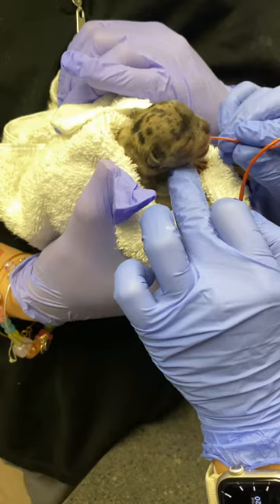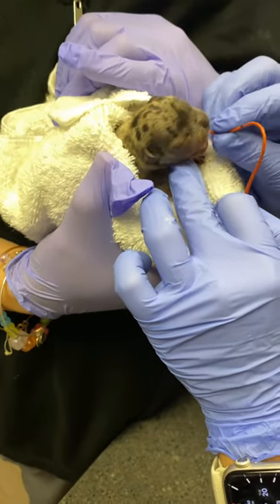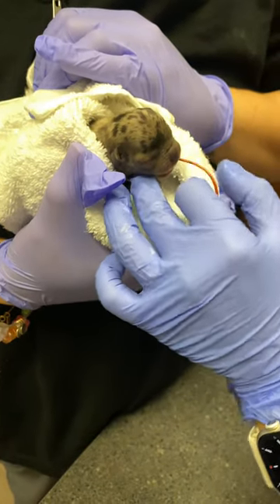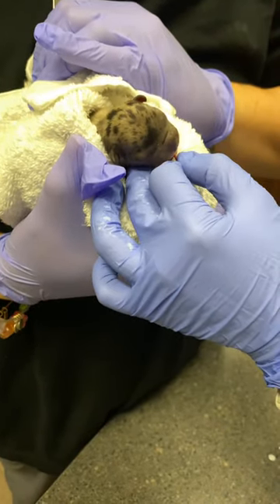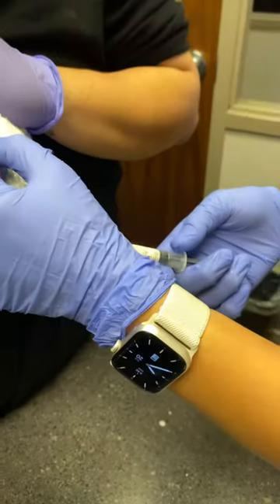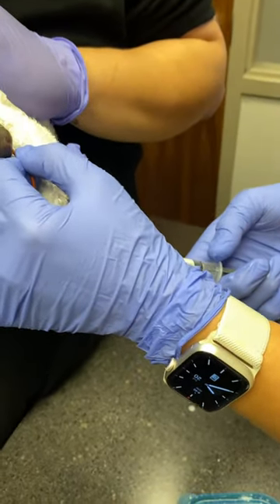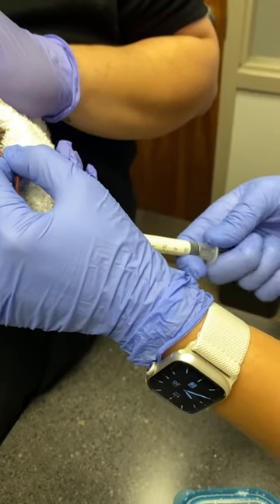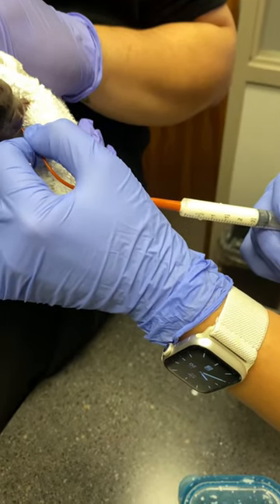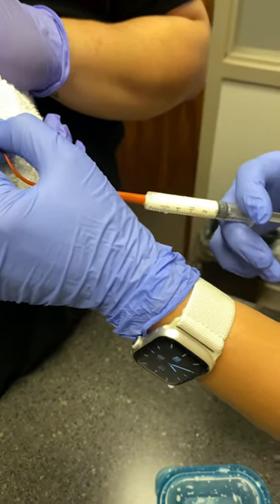Keep going up until that mark. How you know you're in the stomach is when you pull back and you shouldn't get any air. If you get air, you're in the lungs and you should not feed. If there's no air, no bubbles, that means you're in the stomach and you can go ahead and slowly push.